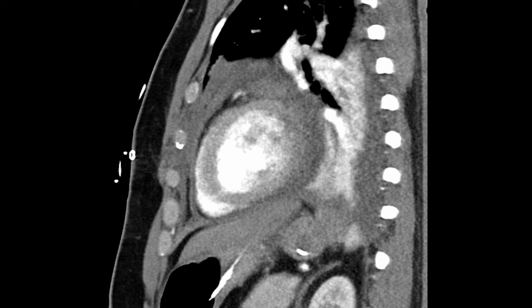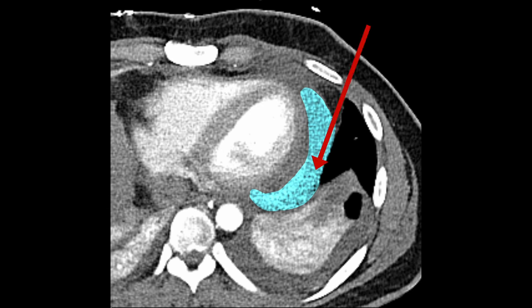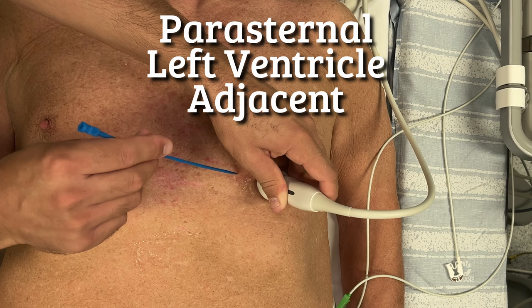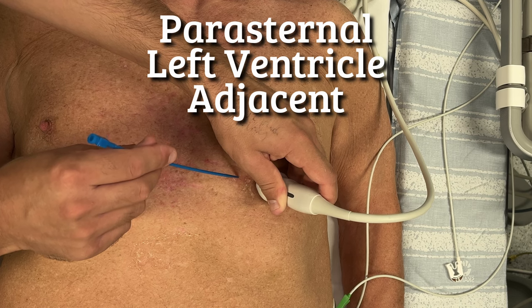Furthermore, there are technical limitations. Here's a case where most of the fluid is located far from the needle path, making it difficult to reach with the sub-xiphoid approach. Here's another view of the same patient, where you can see how the fluid is distributed along the left ventricle, and a red arrow showing a plausible ultrasound-guided path. Most patients can be approached parasternally. These approaches allow for in-plane needle visualization, lowering the risk of inadvertent puncture of nearby vital structures.